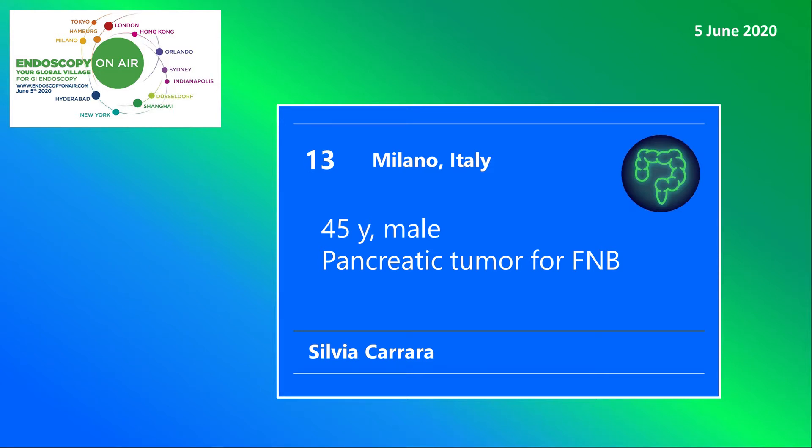Welcome to Endoscopy on Air 2020. Watch Silvia Carrara from Milano performing EUS-guided puncture of a pancreatic tumor.